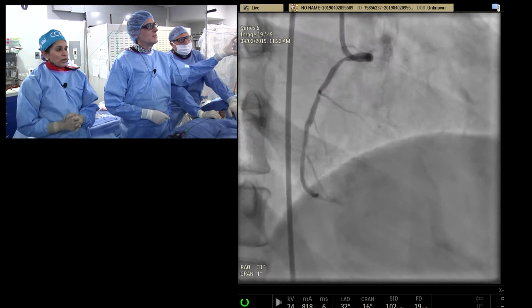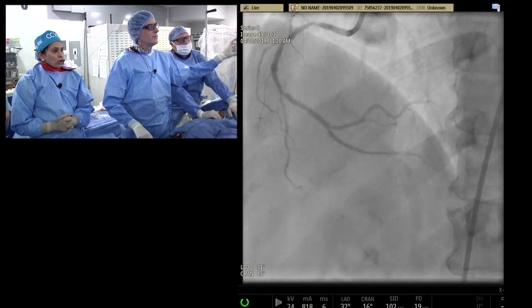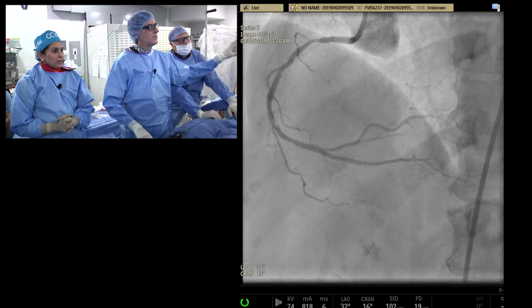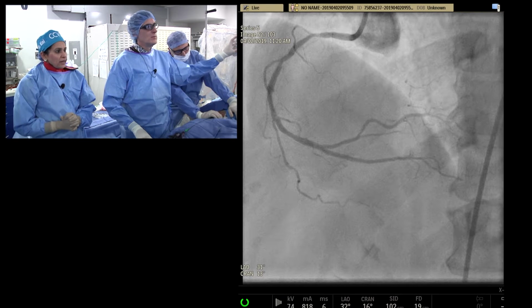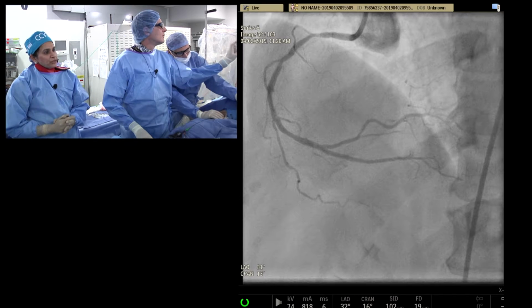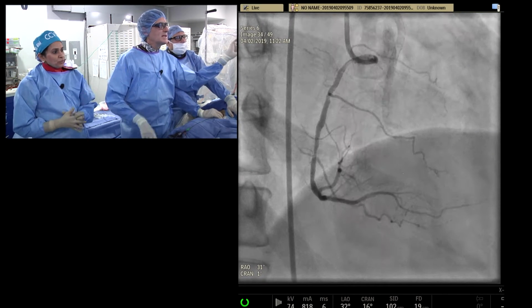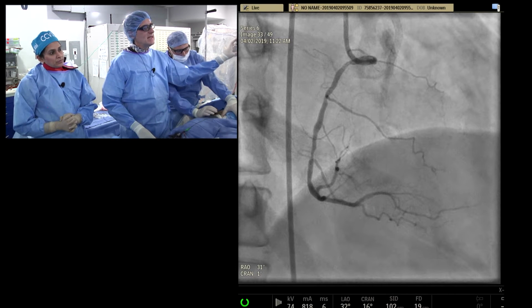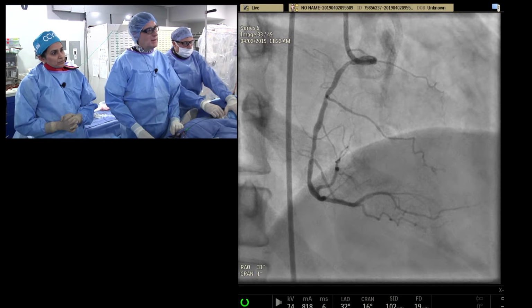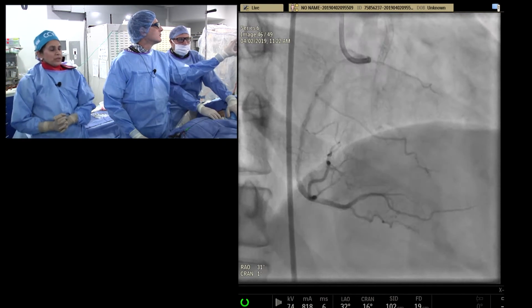So in this patient, she does have significant disease of the proximal RCA. The proximal RCA is the part of the RCA just after the guide up to the first RV marginal. Then there is moderate disease, about 60-70%, after the RV branch. You can see in this view also, very eccentric in the middle of the RCA, at the middle of the screen around maybe 9 o'clock. So we have a long 80 millimeter lesion in this patient.